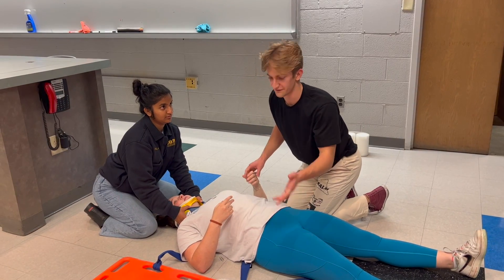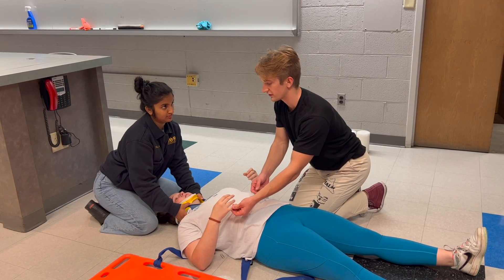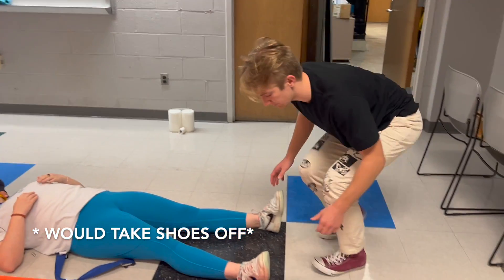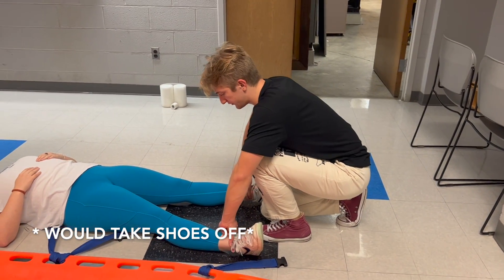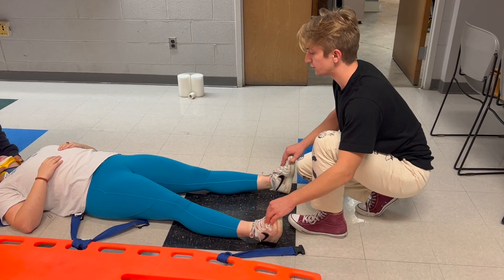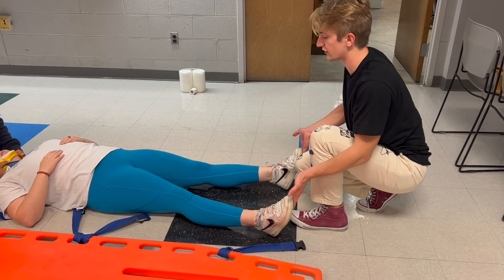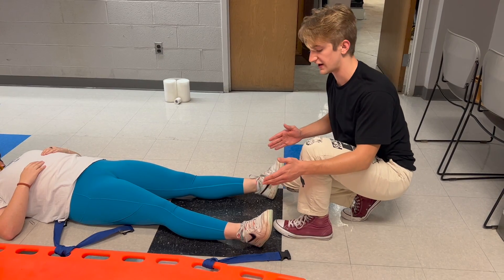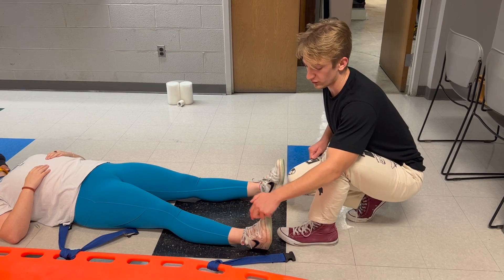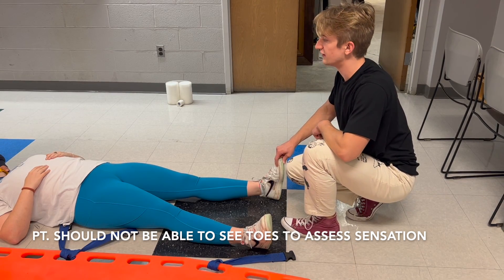This patient is conscious. I'm going to ask her to squeeze my fingers bilaterally, noting if there are different strengths on either side, and then individually on each side ask if she can tell which finger I'm touching. The process is very similar on the feet — I'll feel for a pedal or distal pulse, ask the patient to push up and then push down, noting any discrepancy between sides. Then I'll remove her shoes and ask her to identify which toe I'm touching, one at a time.